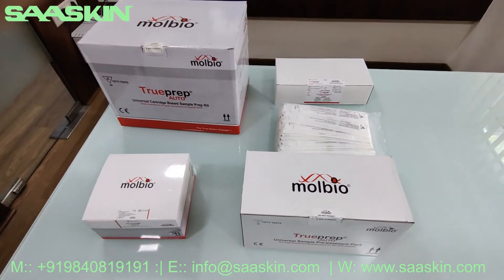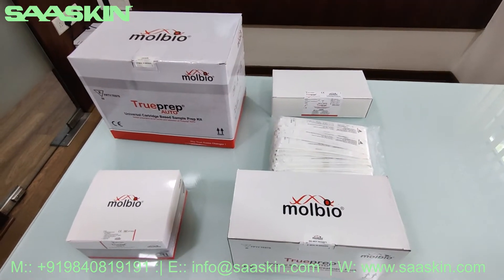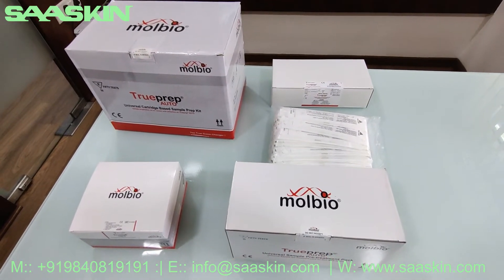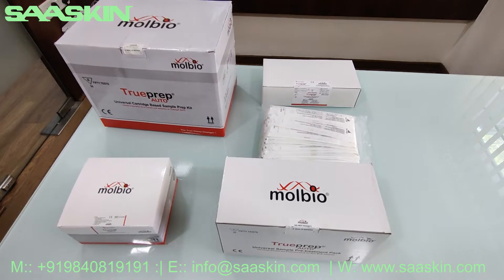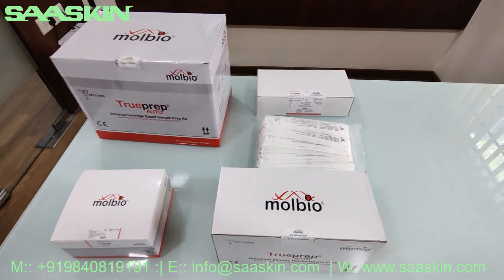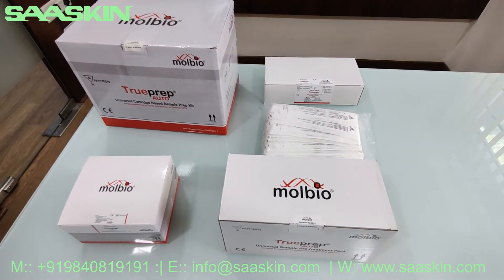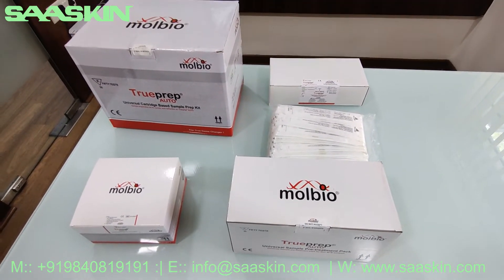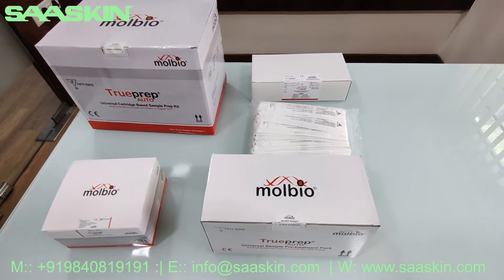Hello everybody, today I would like to give you an introduction about the PCR consumables for the Molbio TrueNat instrument. I am quickly going to tell you what product is required for each test. I have a set of boxes for the tests and I am going to give you an introduction about each of these.